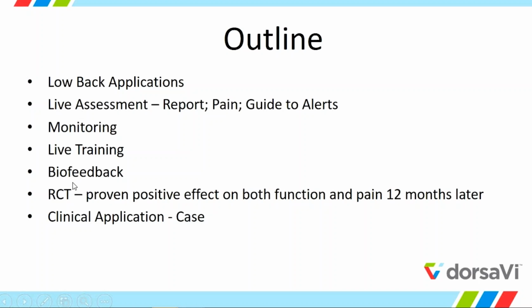We'll talk about biofeedback, and we're going to go into the RCT, the randomized controlled trial that we did, that gives us the ability to talk about our low back assessment in terms of treatments and outcomes, because we've proven that there's an improvement in both function and pain. And then we have a case.